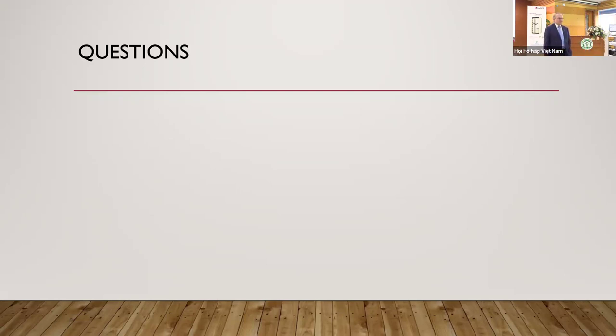Well, let's answer that one first. Yes. Okay, all right. So if you identify by onboarding that there is a bias from one system to the other system in a normal individual, it's challenging to understand what that effect is on the patient results. Right, because their results may be higher or lower than your comparison person. But from the interpreter standpoint, if there is a change, let's take diffusion as an example. This system gave me a value of 25. The new system gives me a value of 23.